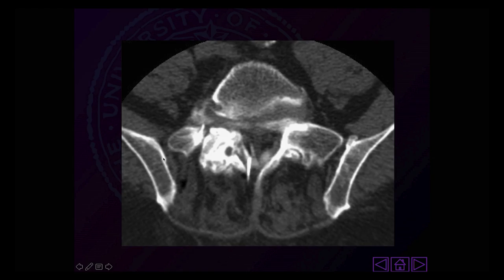Okay. You can also get there by going down the middle. So here's that epidural space. Here, a patient has pretty advanced facet disease and back pain. So if you have predominant back pain, this is a nice place to go to coat the area. If you have leg pain, you want to definitely get the nerve that's in the foramen. Those patients who have both often can be injected in both places.